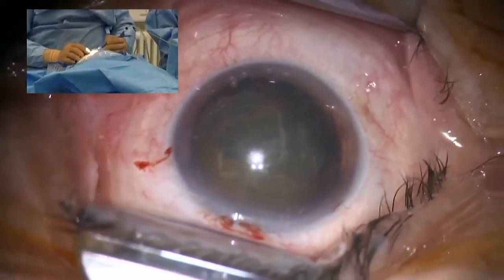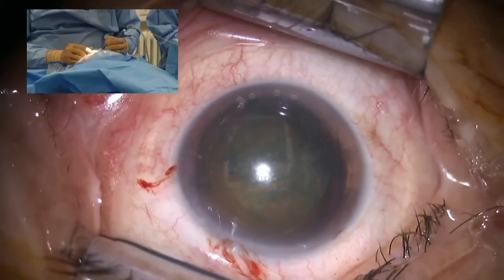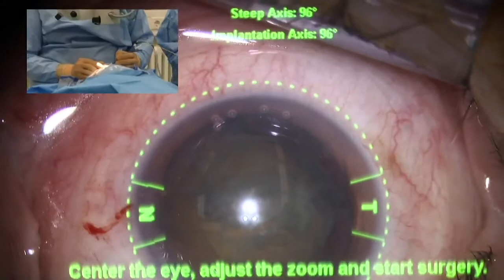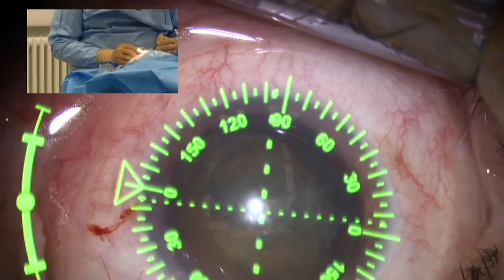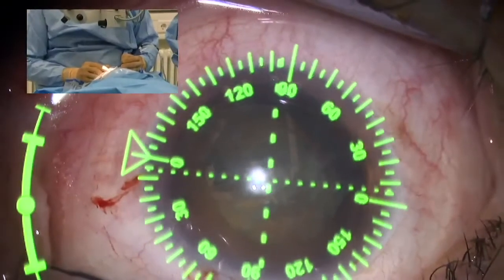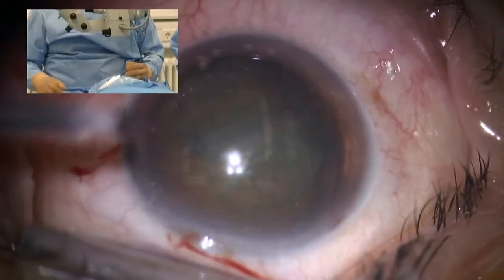Kann man bitte die Dings nochmal haben, die torische? Oben könnt ihr draufdrücken. Start. Ja. Start. Confirm. Ja. Jetzt ausschalten, die 2 Punkte.